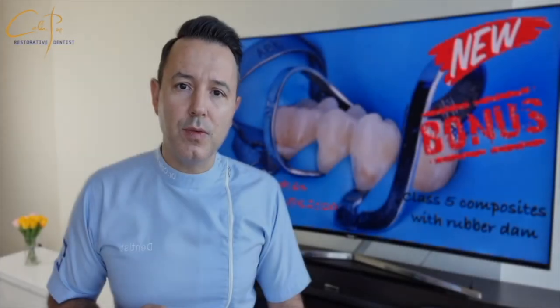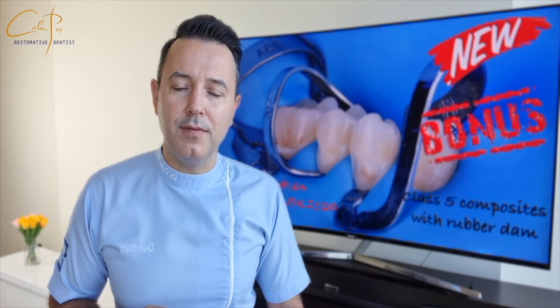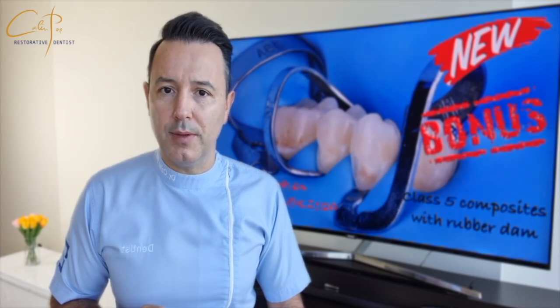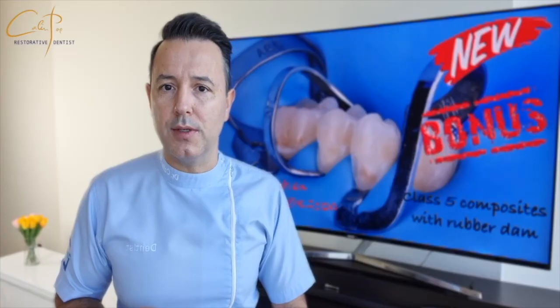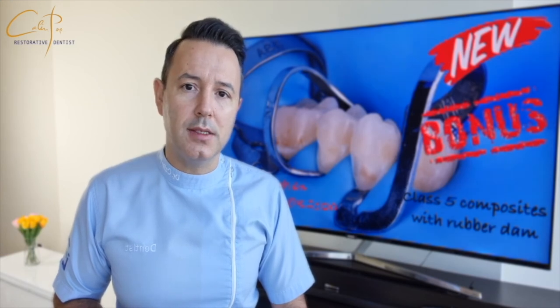Most of the time when treating class 5 caries with composites, the isolation with rubber dam is considered to be difficult, and very often dentists feel pushed to give up and use traditional methods like retraction cords to control the crevicular moisture. Cords can indeed be a solution to retract the soft tissue next to the cervical area, but we know that this is not enough.